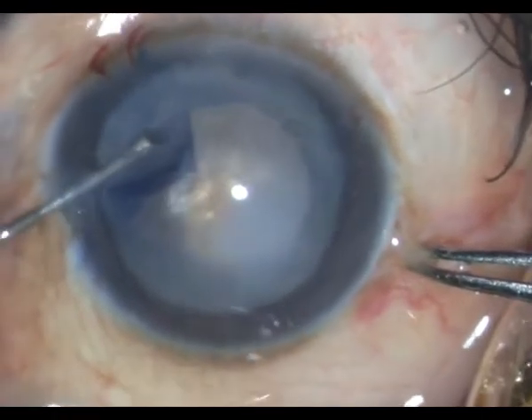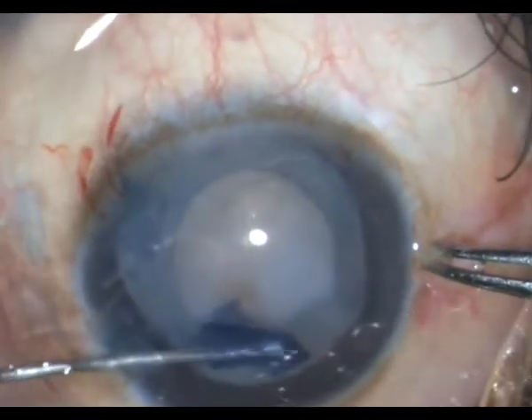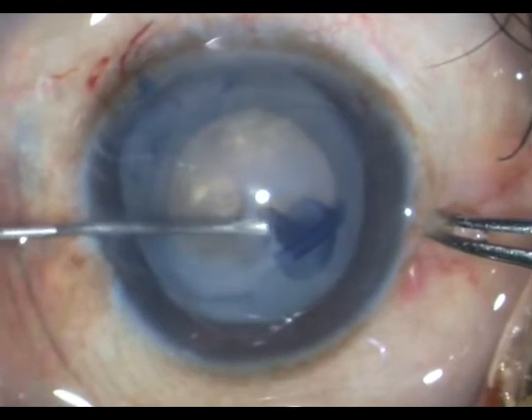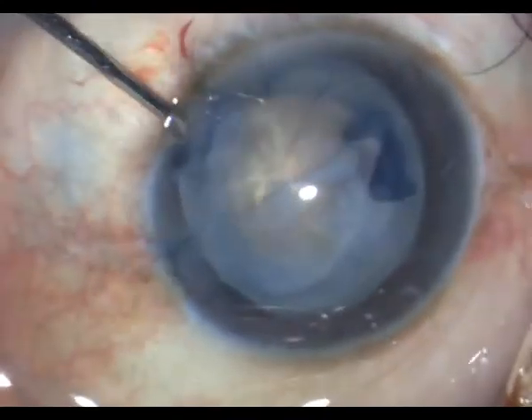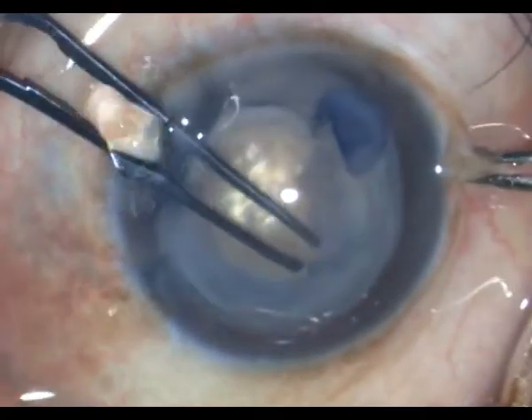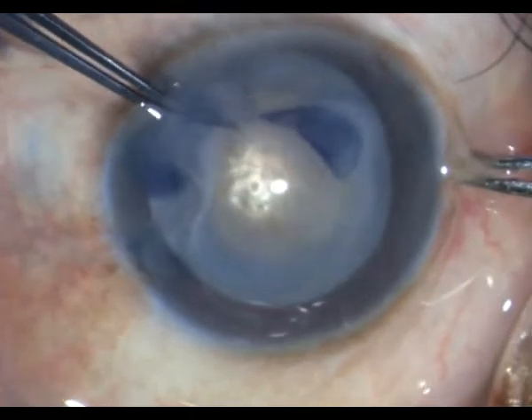I could always use forceps as well, but I am not exactly having any problem with the cystitome and I make sure that I complete the rhexis. As you can see there is still a tag left, which I complete with the Utrata forceps.